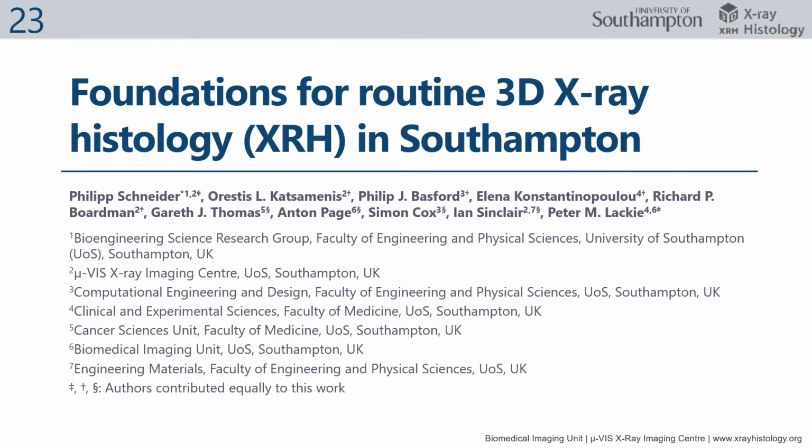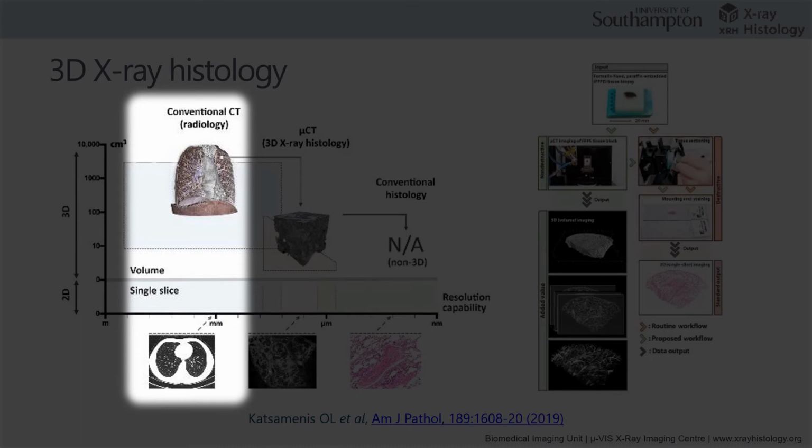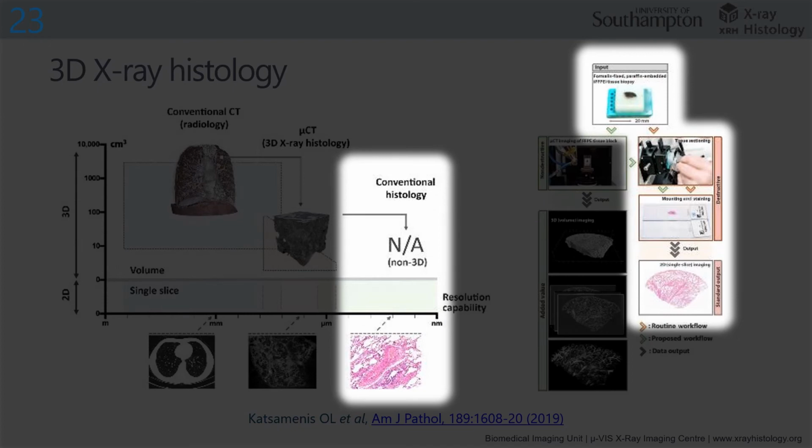We present here our recent work on the foundations for routine 3D X-ray histology in Southampton. 3D medical imaging is commonplace, such as this conventional clinical chest CT. Yet microscopic tissue structure analysis remains overwhelmingly wedded to 200-year-old practices of microscopic 2D examination of tissue sections.